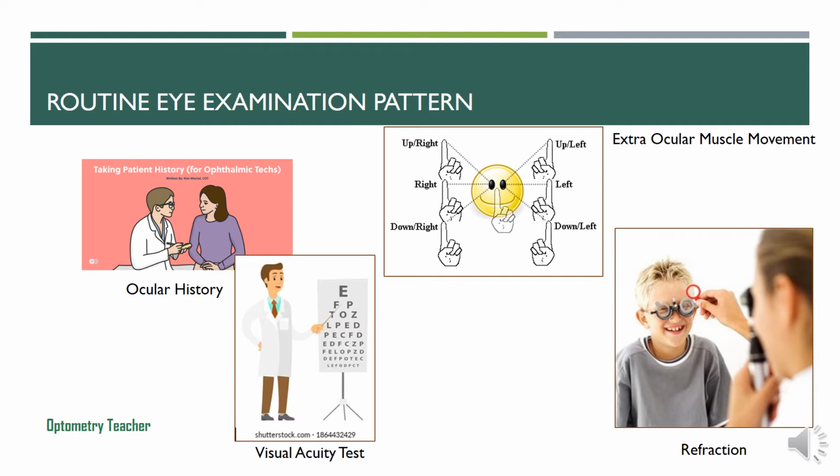Next thing is about the extraocular motility or the muscle movement. How are we going to go ahead with the muscle movement? We need to make sure that all the extraocular muscles are perfectly working and that makes the eyes move comfortably. So that extraocular muscle movement testing is also an important one.